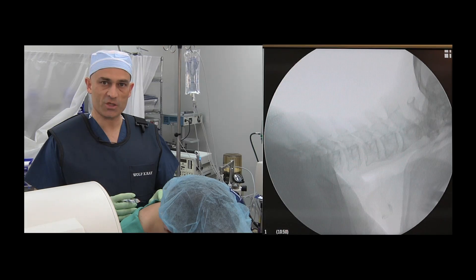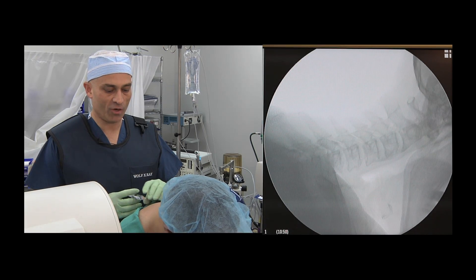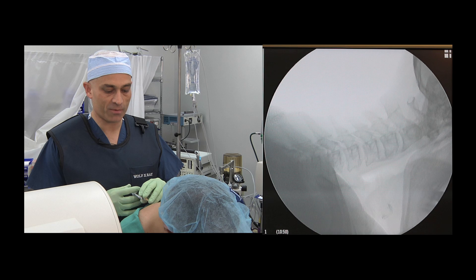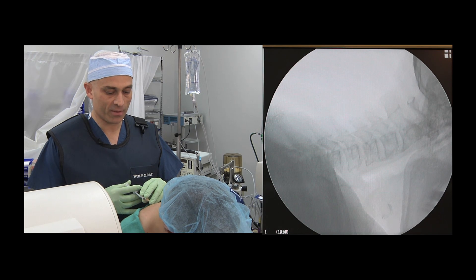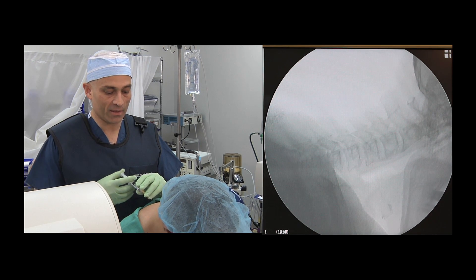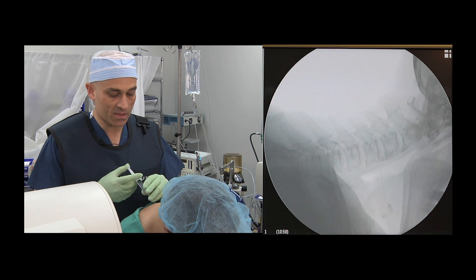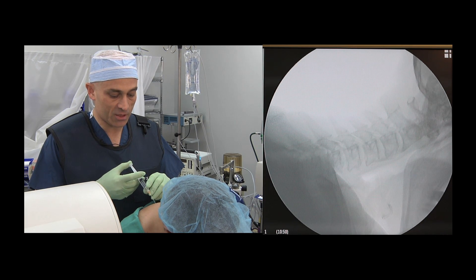The procedure commences with the injection of some local anaesthetic into the subcutaneous region. A little bit of 1% lidocaine is injected to anaesthetise the skin and subcutaneous tissues.